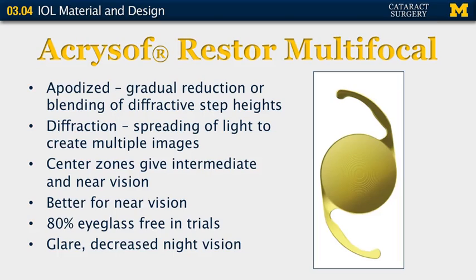There are drawbacks to this particular lens in that patients do tend to experience some glare from bright lights or headlights at night, and the sharpness of the vision is not as good at night.